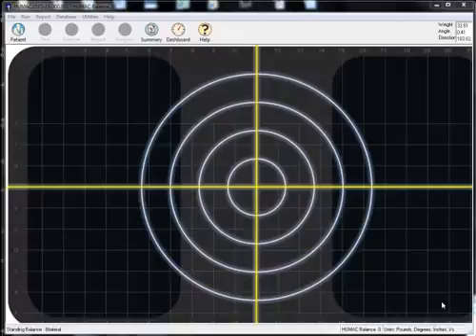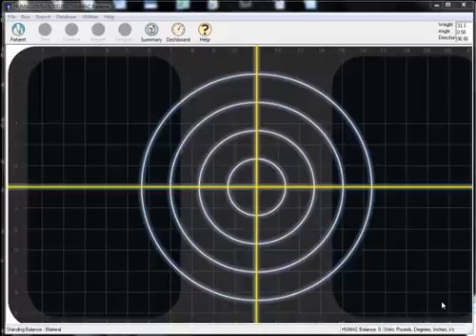With Humac Balance during exercise, patients will see in real time how they are distributing their weight so they can correct their performance in real time without the aid of a mirror or a clinician providing feedback.